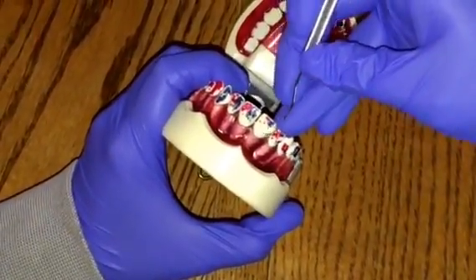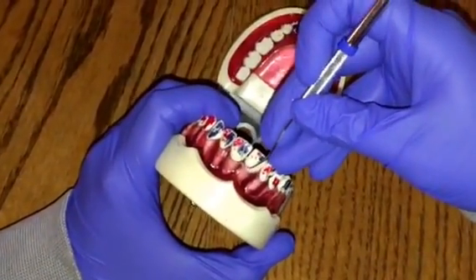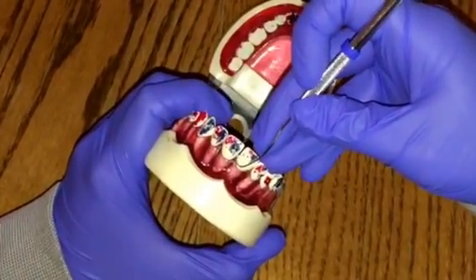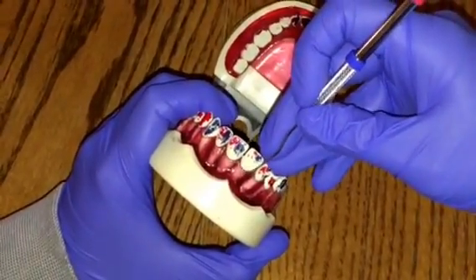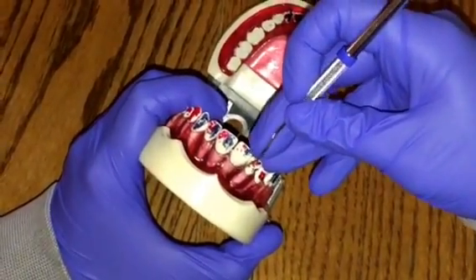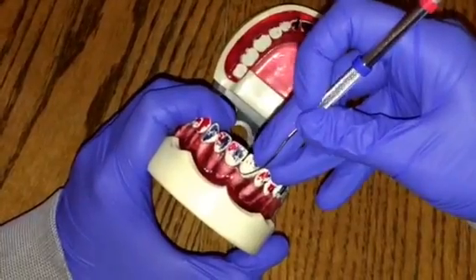So again, starting here, across the midline, going into the col and backing out. And one more time, starting across midline and safely backing out.